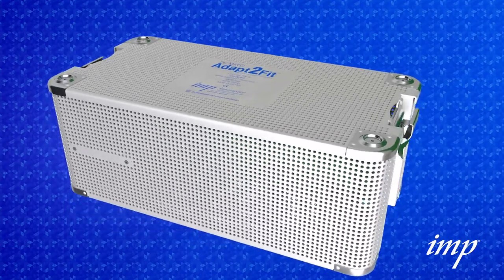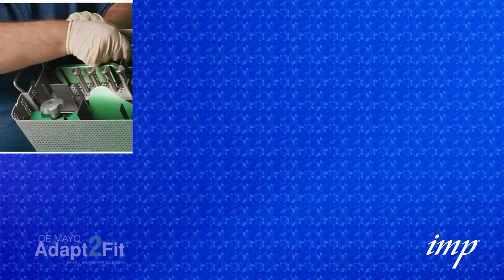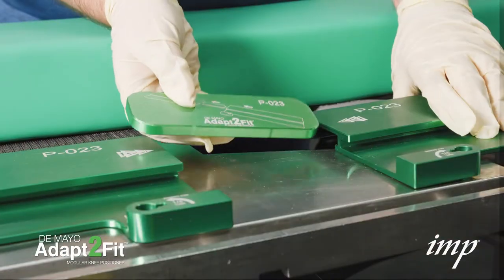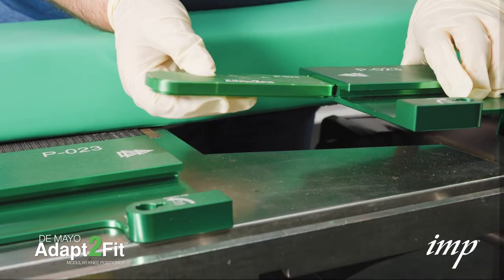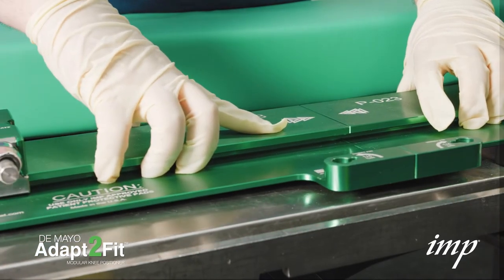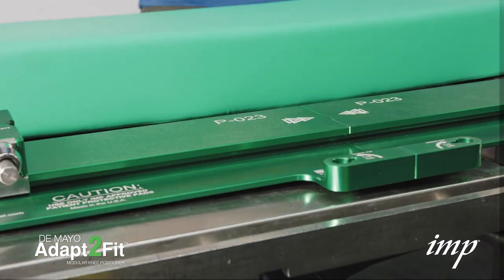Now, open the sterilization tray and remove the base plate halves and the base plate connector. Insert the base plate connector into one half of the base plate until it stops. Connect the other base plate by sliding it onto the protruding base plate connector until the base plates meet.